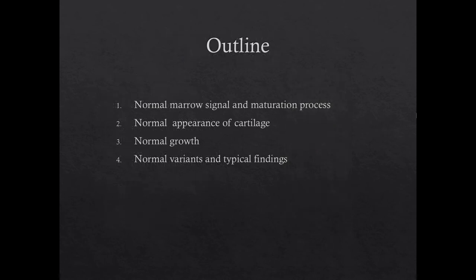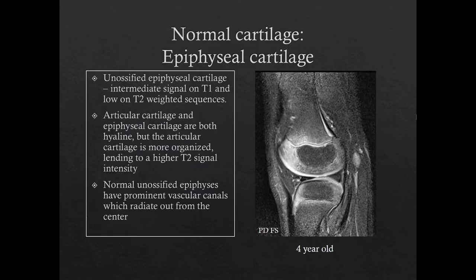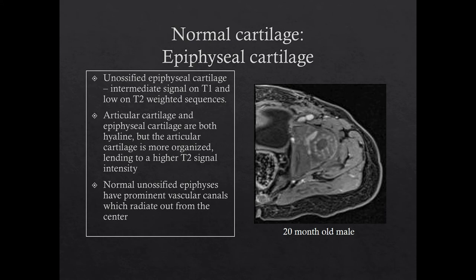Next, we will move on to a discussion of normal cartilage. Unossified epiphyseal cartilage is comprised of disorganized hyaline cartilage, which binds water poorly. Therefore, it is of intermediate signal on T1 and fairly heterogeneous or low signal on T2-weighted images, although some areas are relatively higher in signal on T2, which is normal. The adjacent articular cartilage is more highly organized hyaline cartilage, and so is brighter on T2-weighted images and is clearly distinguished here. Unossified epiphyseal cartilage has vascular canals that radiate out from the center, which may be visualized on post-gadolinium sequences in either a speckled or spoke-like pattern, as seen here.